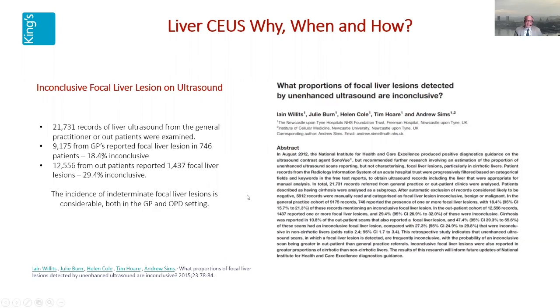And the current practice with most people is, if you think it's benign, you may follow it up in 3 months. If you think it's malignant, you send the patient through to a cancer pathway, with all the downstream costs involved. But importantly, as I've mentioned before, it's the patient here that's more important. You've done the scan, you think it's malignant, you refer it back to the GP, who refers the patient to a clinic, 2-week pathway, the patient is seen, further investigations are ordered, 60, 70, 80 days later the patient gets the result, and it's benign. So anxiety has been there for 2 or 3 months.